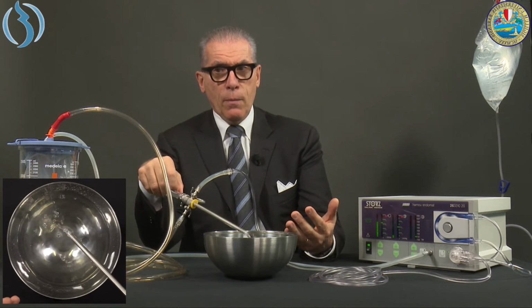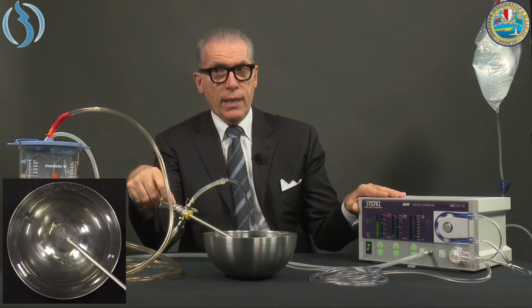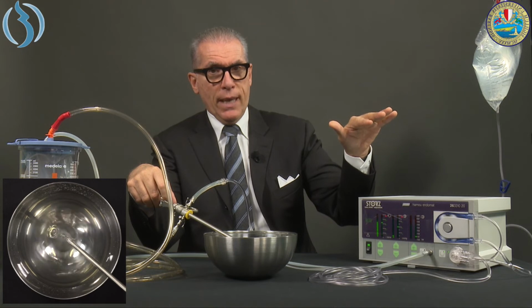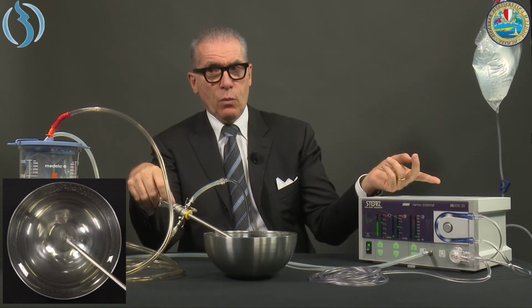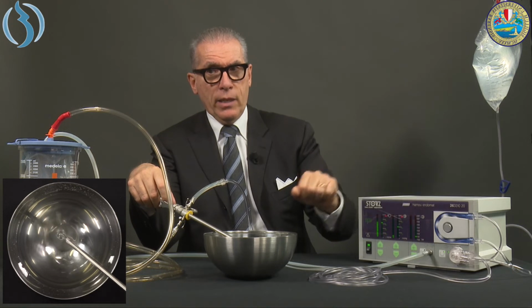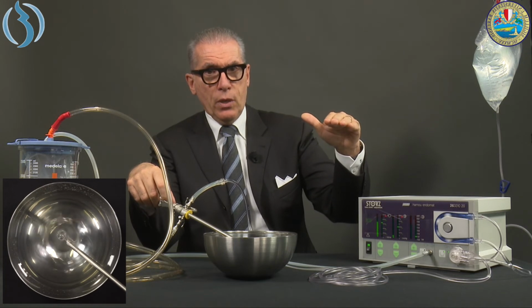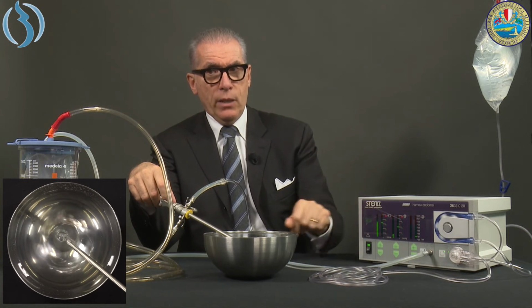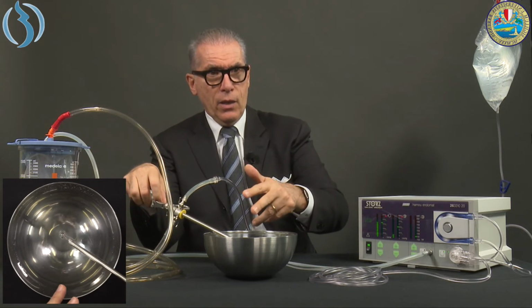So you see now, the pump is not perfectly located. As I told you when I described the easy pump, the pump must be a little bit higher than the body of the patient. Otherwise, the gravity pressure will affect the system. This is the reason why a couple of LEDs appear highlighted in the pressure sensors. If you move this a little bit higher, in this position compared to the body of the patient, you will see that even the two LEDs will go off. Now the canister is getting filled by the water.